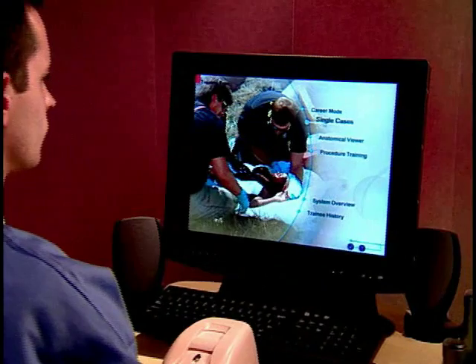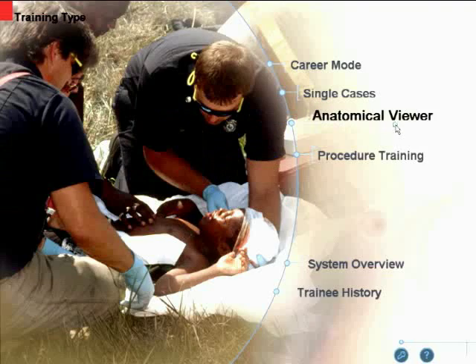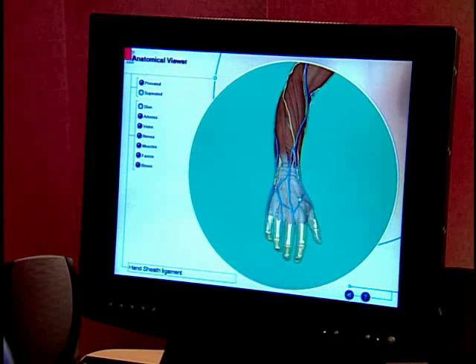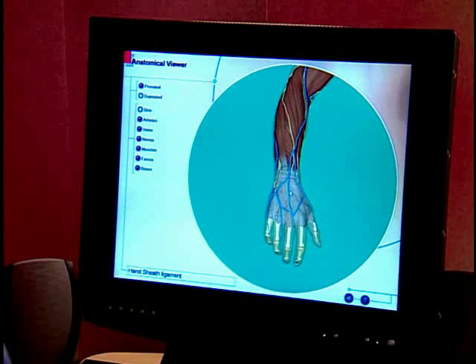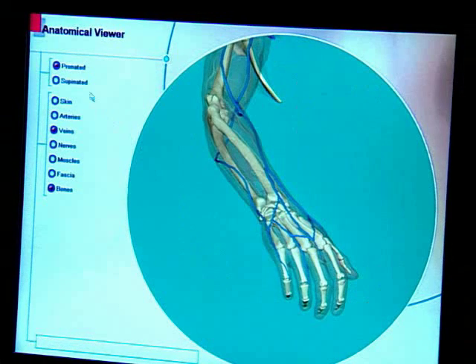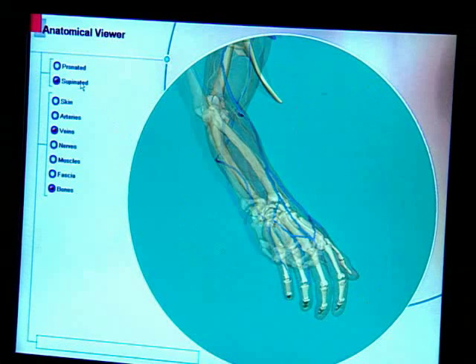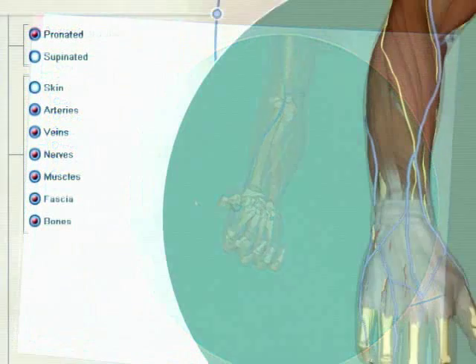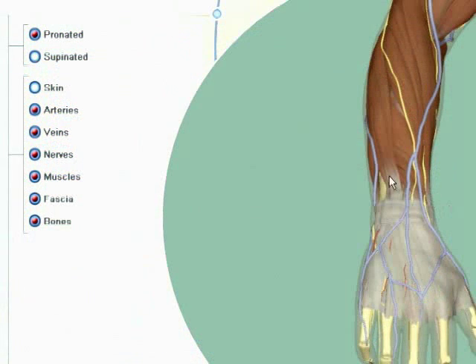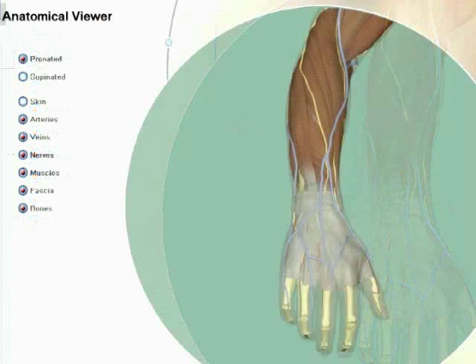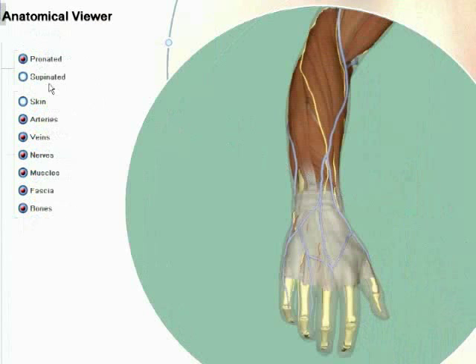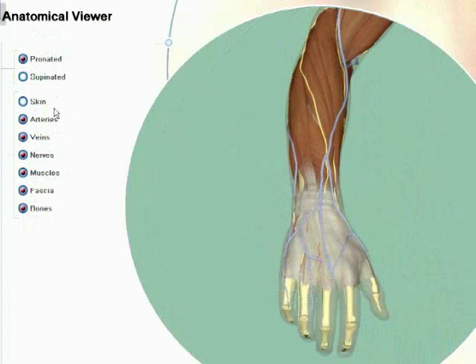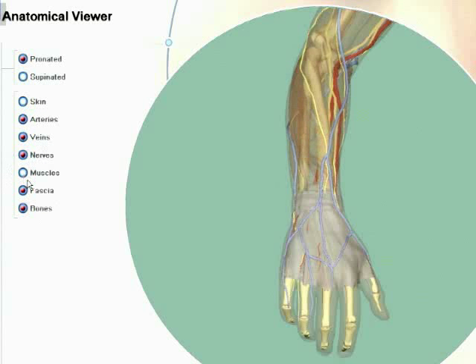To better understand the anatomy of the arm and vein location, click on the anatomical viewer. The anatomical viewer presents an interactive 3D model of arm and hand anatomy. After the arm loads, two lists of options — arm positions and anatomical structures — will appear at the left. To choose a pronated or supinated view of the arm, click on the corresponding button.